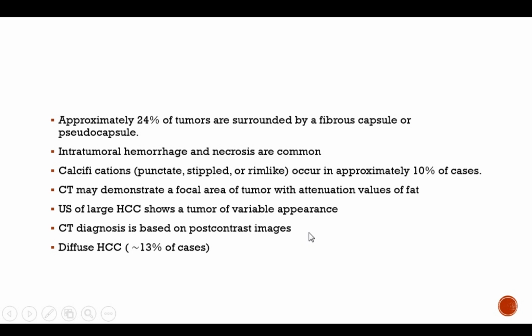They are deformed, histologically abnormal. So the blood flow in them is not like the rest of the liver, so it keeps contrast. Hepatoblastoma has the same feature. All malignant lesions should have it; if they don't have new vascularity, they will not grow as fast as they do.